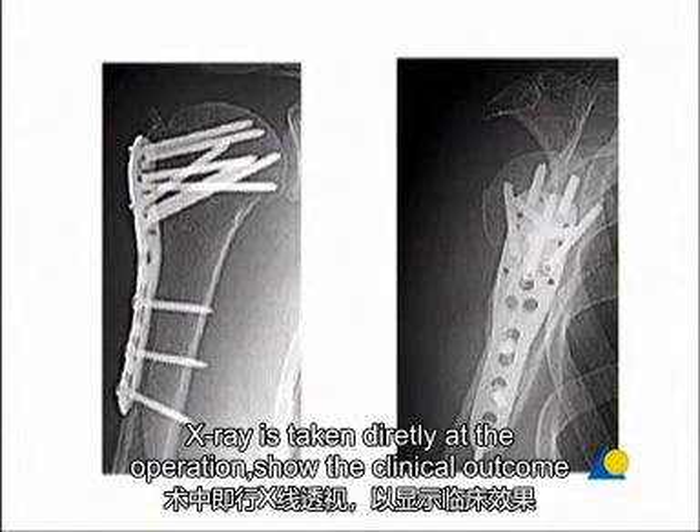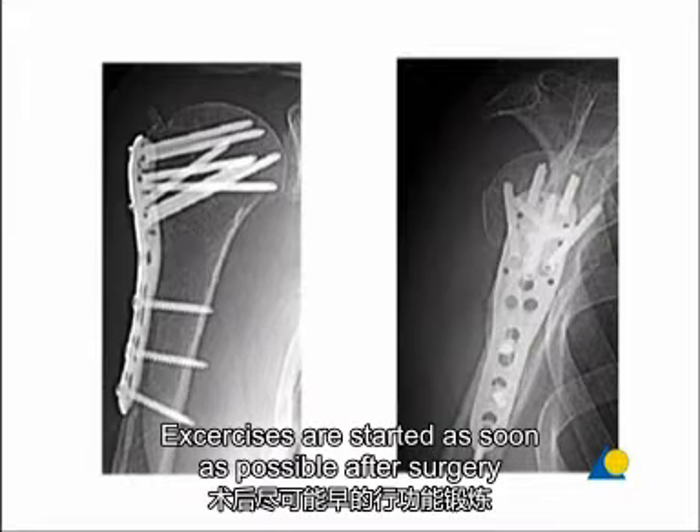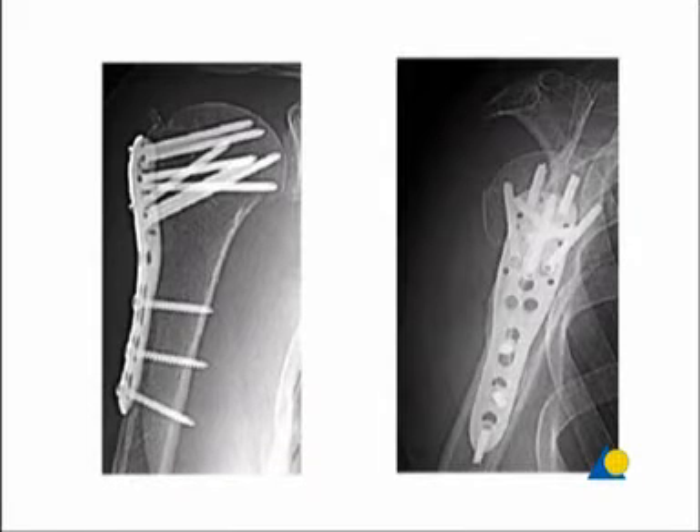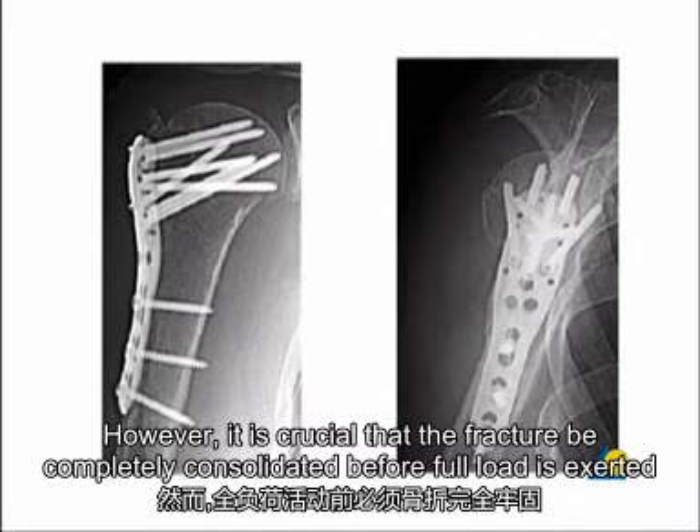X-rays taken directly after the operation show the clinical outcome. Exercises are started as soon as possible after surgery to prevent any later restrictions of movement. However, it is crucial that the fracture be completely consolidated before full load is exerted.